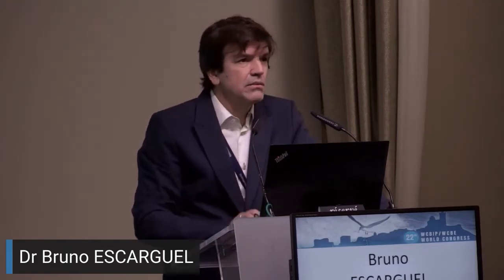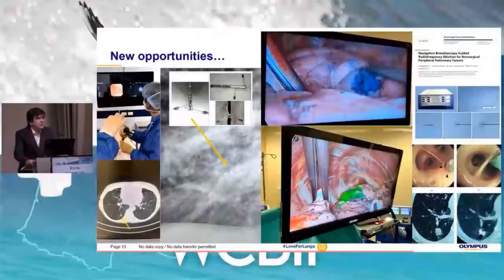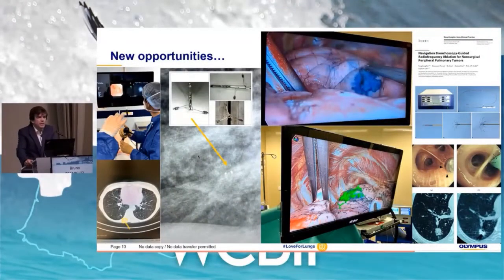So this is the real time for the diagnosis, but the opportunities to enlarge the part of diagnosis is first to be collaborative, as I told you, to help the radiotherapist by putting fiducial markers, or to help the thoracic surgeon. For example, for the GGOs, you have to help him to say, okay, go this way, so you can do a pleural marker with the methylene blue or the indocyanine green.